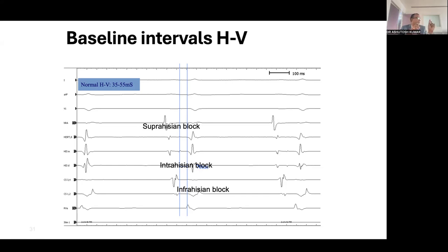So His is the important structure. EP revolves all around the His. It is like a queen. Everybody is revolving. How is the conduction pre and post? How is it behaving during taking Brady? All that information is in the His. So king is His. Queen is His.